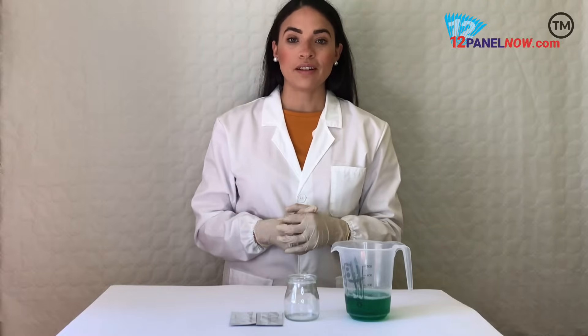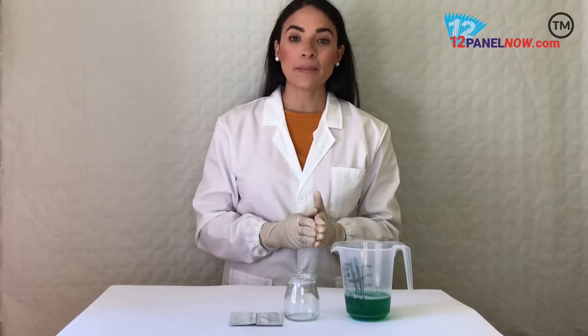Hi, I'm Valerie from 12 Panel Now. I'll be showing you how to use our Rapid Fentanyl Test Strip.